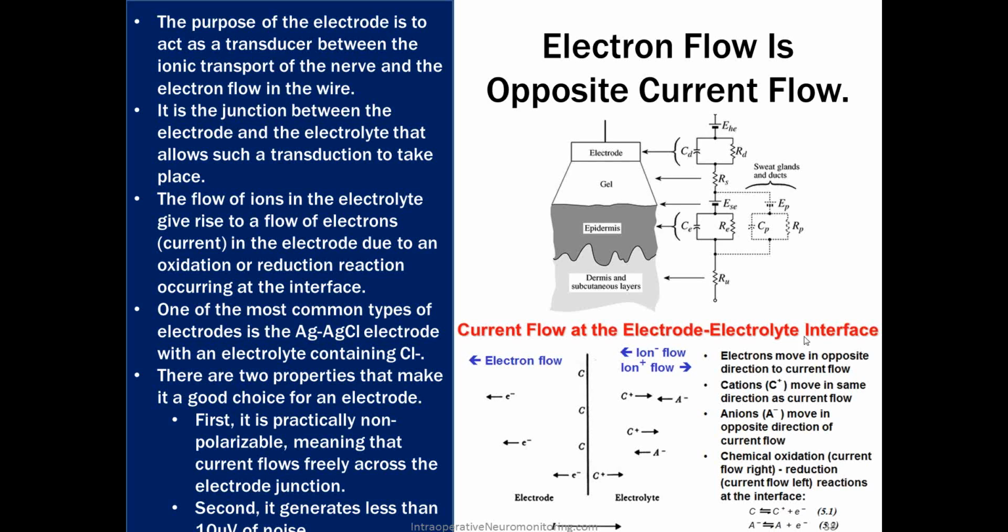So here's a picture of it. Here we have our electrode. We squeeze a little of that gel in there. Here's our skin and here's our subcutaneous layer. And this is our sandwich here of our different resistances that we hope are similar from one electrode to the next.